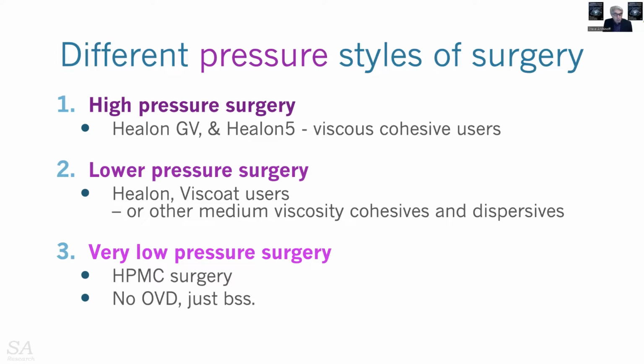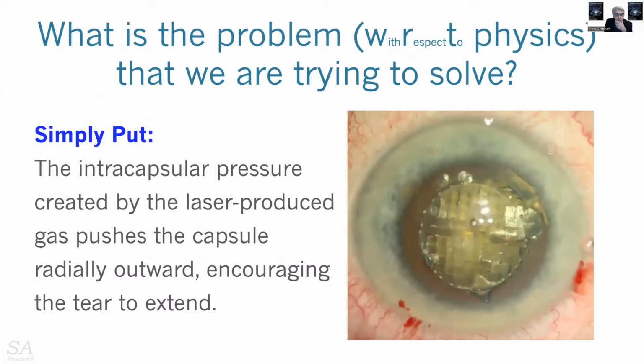And when I watch surgery from those areas, I notice the very ingenious ways people have managed to figure things out so they can either work in lower pressure, or they can manage to increase the pressure by making a very small incision first and pressurizing the eye with HPMC, doing what they want, requiring high pressure initially, and then changing to the rest of their technique. So in these cases, what you have to do is learn how to look at them.